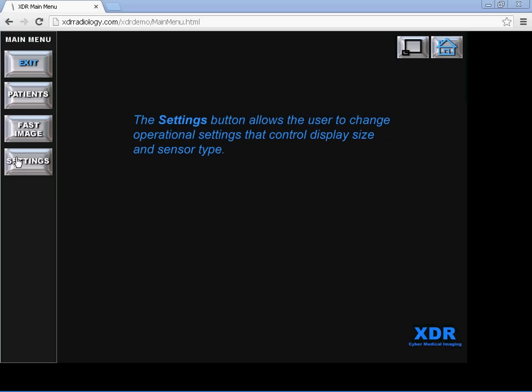And the Settings tab allows the user to change operational settings that control display size and sensor time.